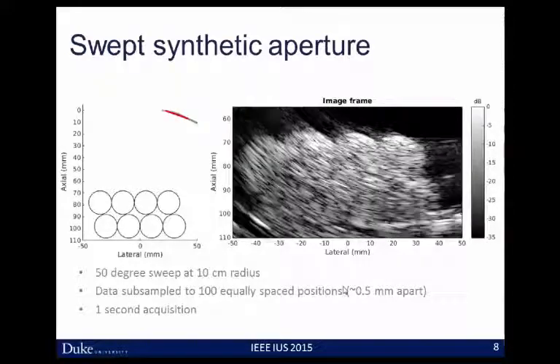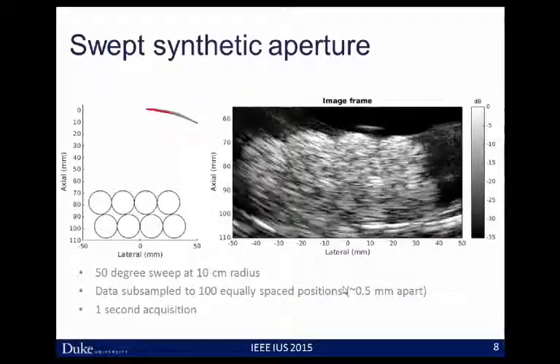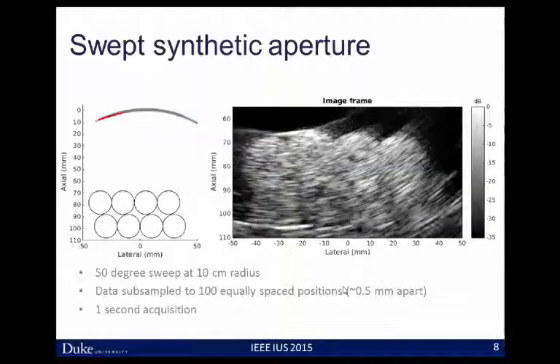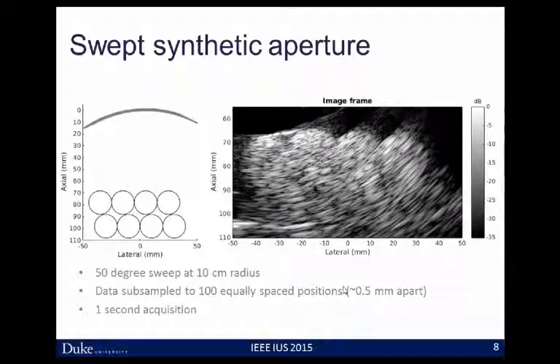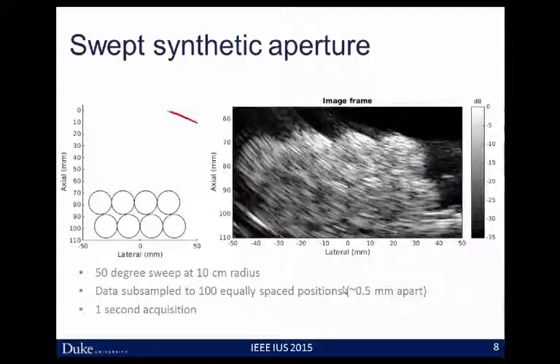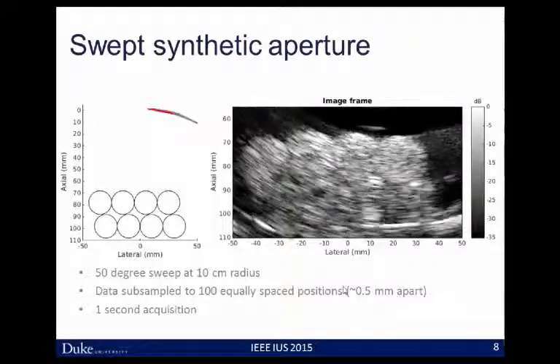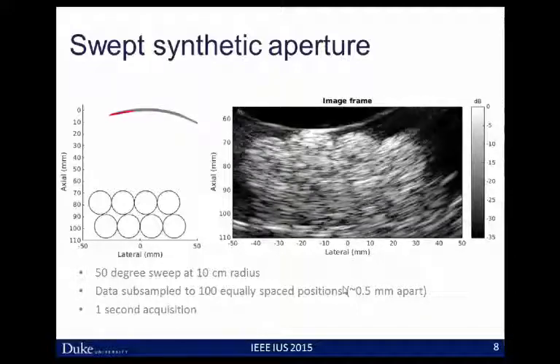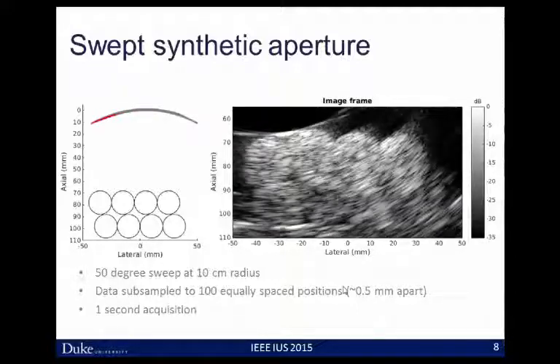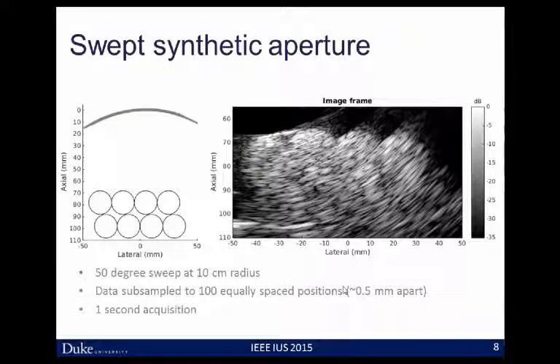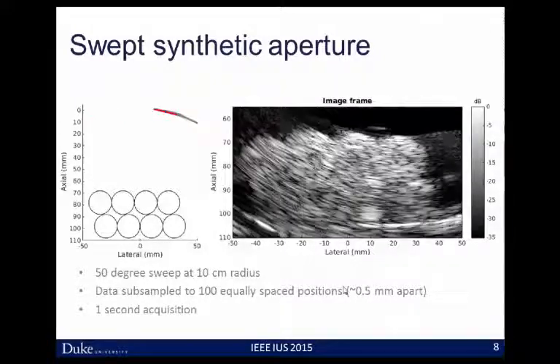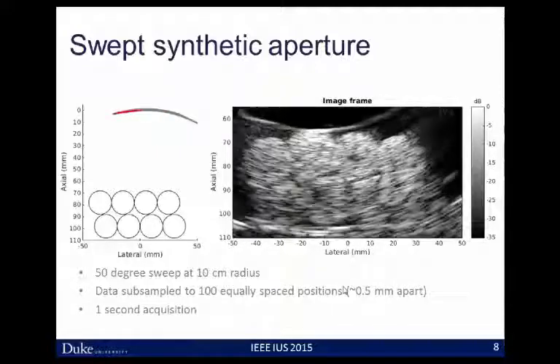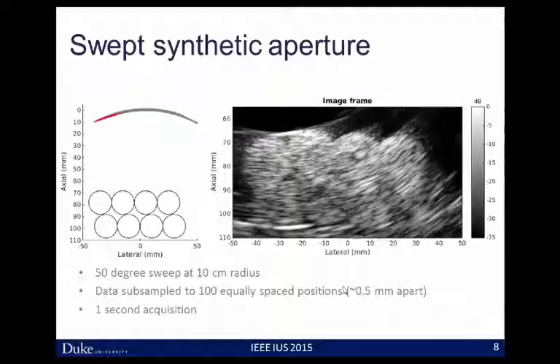Here's an example of what one of those sweeps looks like. In the cartoon, you can see the active red aperture sweeping from right to left — a 50-degree sweep at a 10-centimeter radius. On the right you can see the sample image frames, which are low lateral resolution, coming from a single diverging wave. We're not using all thousand frames since we'd be spatially oversampled. Instead, we subsample the data to give equally spaced positions across the arc, roughly half a millimeter apart, giving us about a hundred frames played back in this movie.